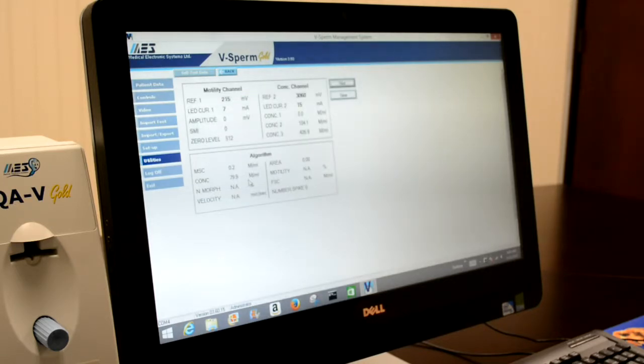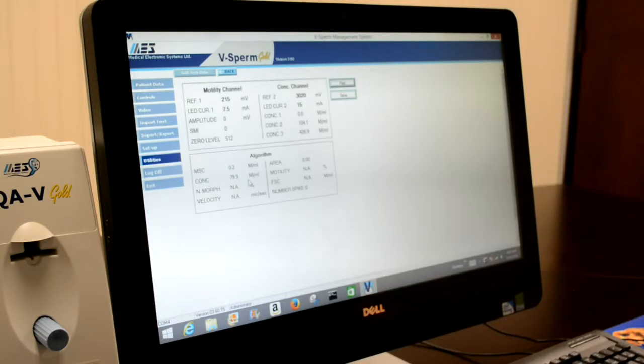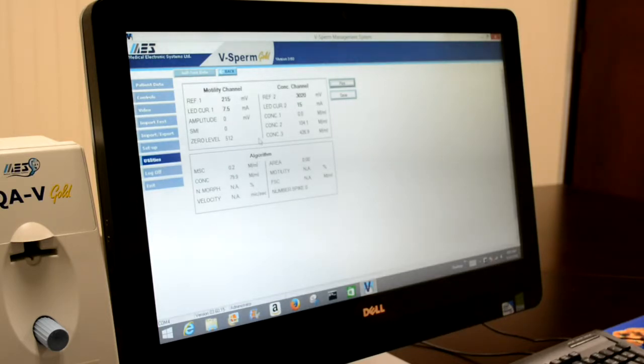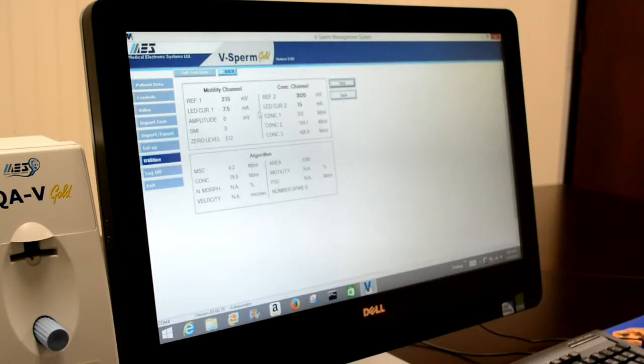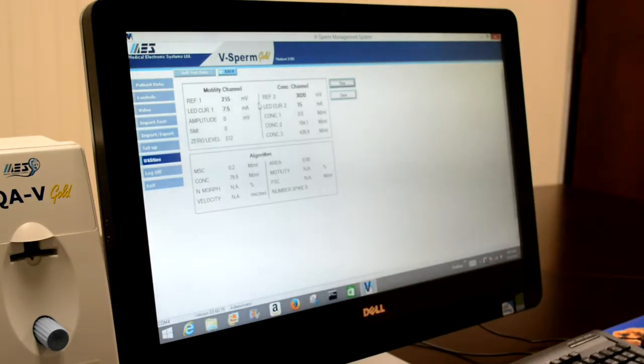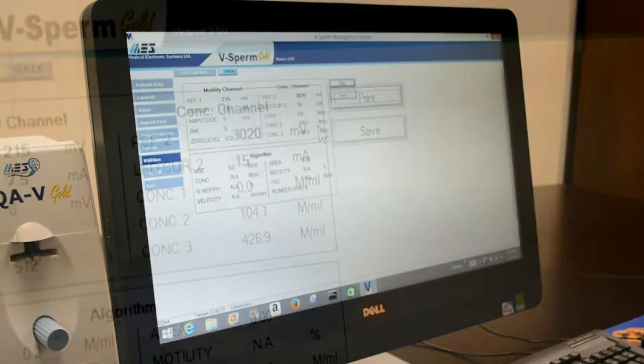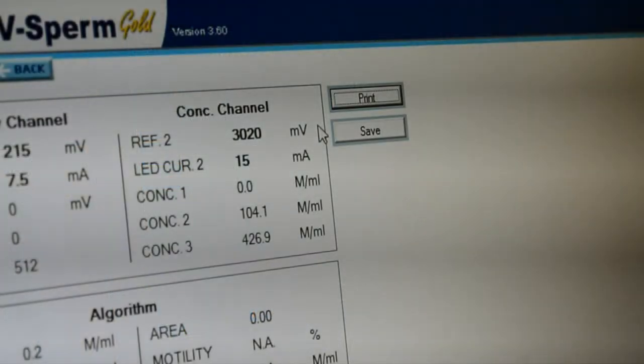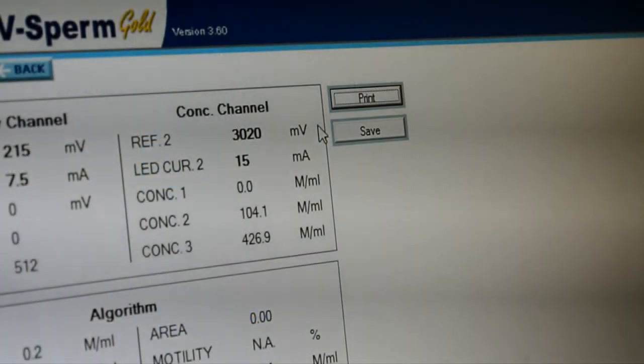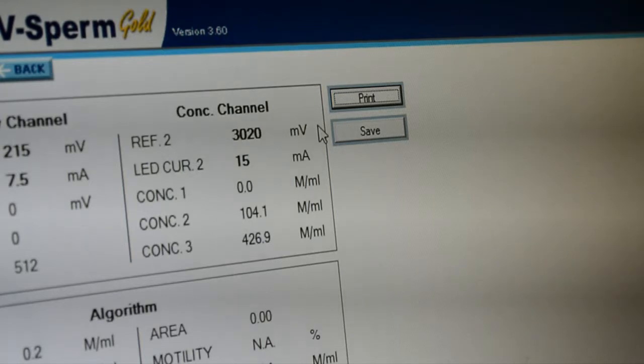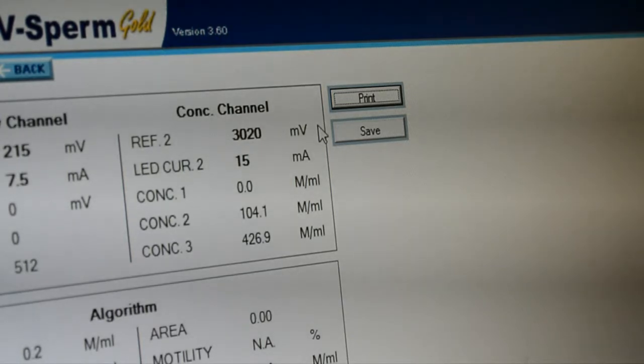You now have a real-time view of the service parameters of the SQAV. There is one key parameter to pay attention to that is a very good indicator of overall instrument health and status. The reference 2 parameter, located in the upper right-hand corner under concentration channel, should be as close to 3,000 millivolts as possible.